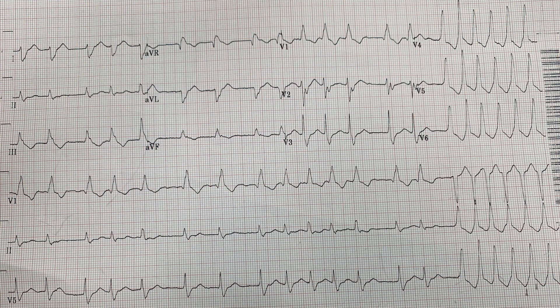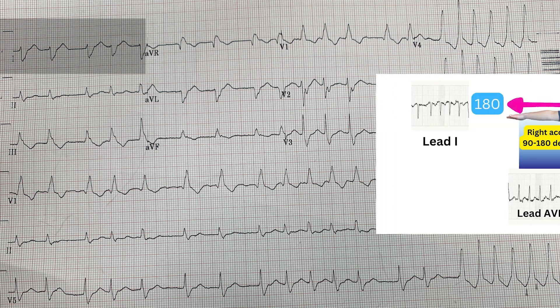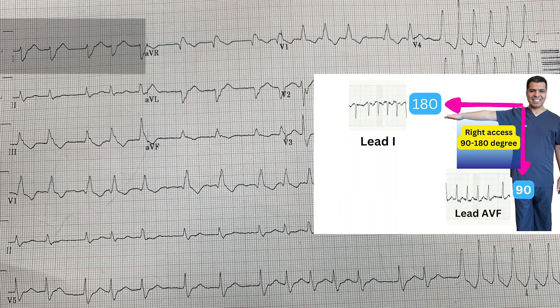Let's move to this EKG. The QRS net deflection is negative in lead 1, meaning it's going in the direction of my stretched right arm at 180 degrees. AVF is positive, meaning it's going in the direction of plus 90 degrees. So the axis is between plus 90 and 180 degrees — this is what we call a right axis deviation.